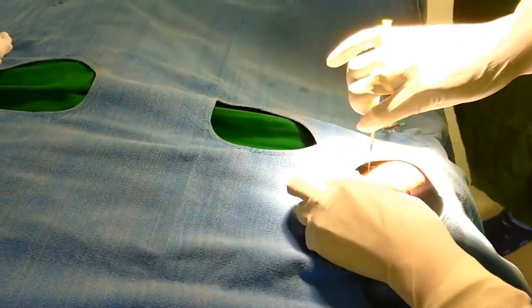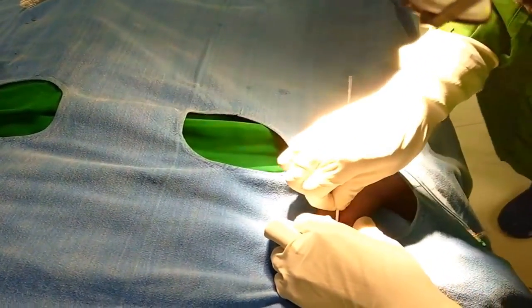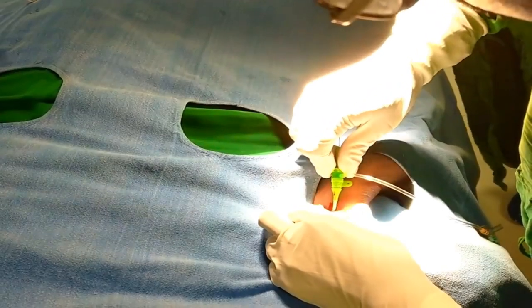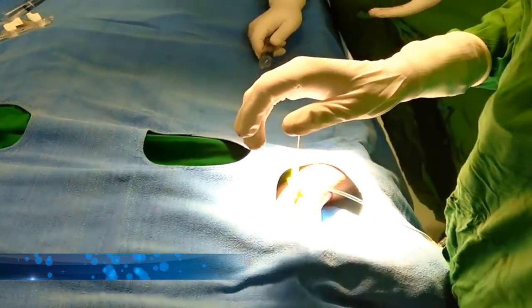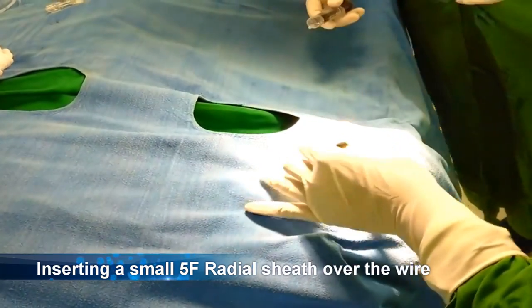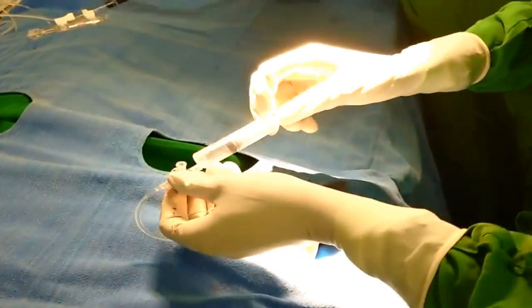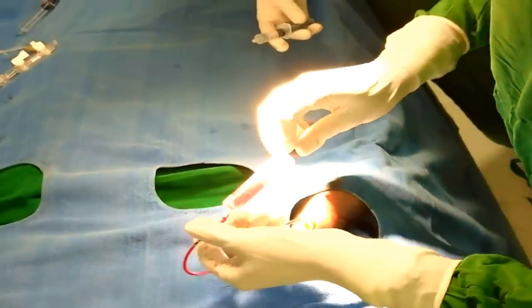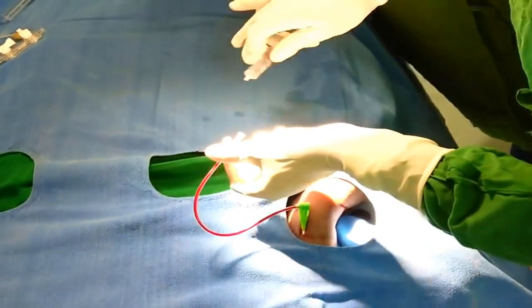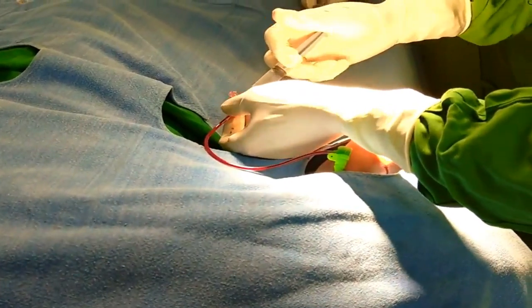After the skin nick, we make a small incision and insert a catheter radial sheath, which will engage the catheter to do angiography. Now we remove the wire and keep only the radial sheath, aspirating with saline-filled heparin.